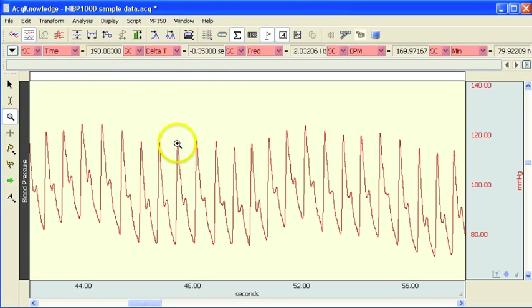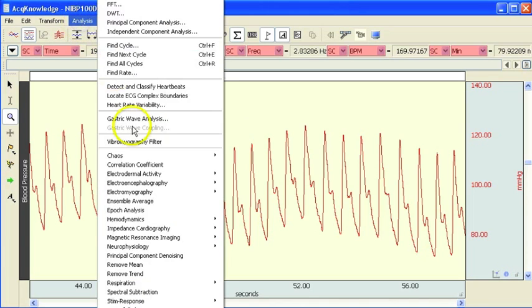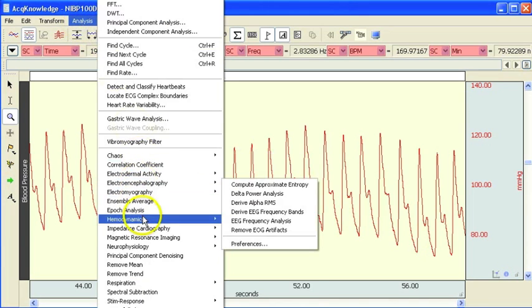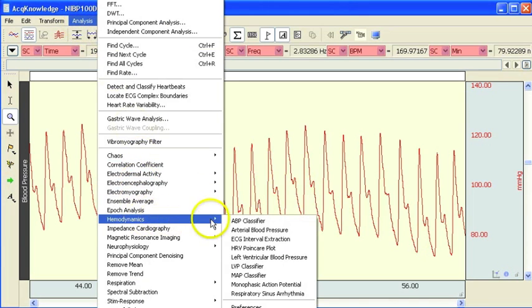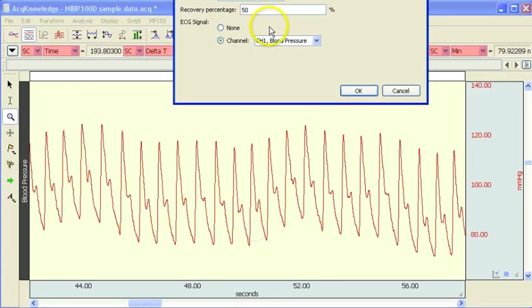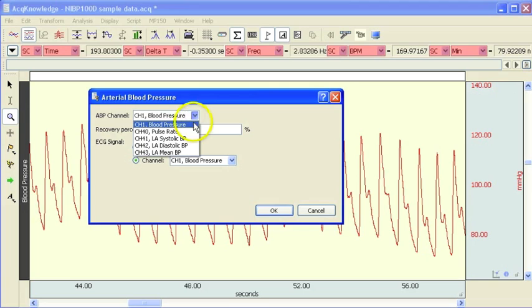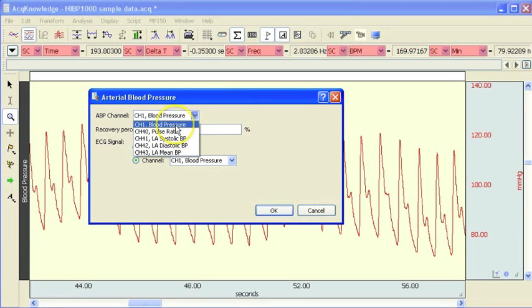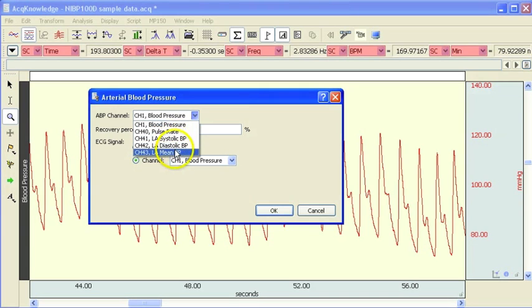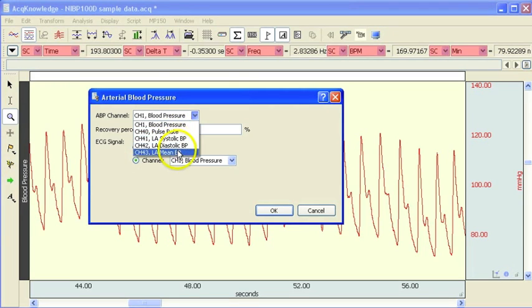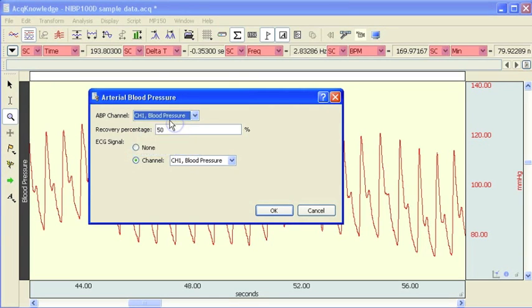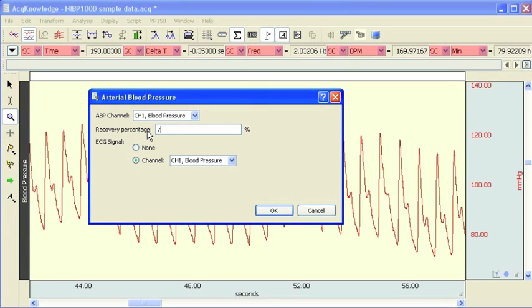Once we've got our file open we need to go to the analysis menu to hemodynamics and arterial blood pressure. This opens up a dialog box where we're asked to identify the blood pressure channel. In this case I'm only showing the blood pressure waveform but we do in fact have a number of other channels in this file. The software will calculate heart rate, systolic, diastolic, mean blood pressure online, but the blood pressure analysis I'm going to show you does have some nice features including additional measurements and the ability to export the data direct to Excel.